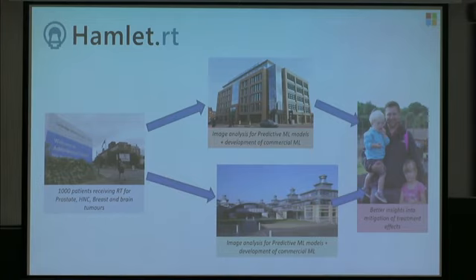So sort of early steps of radiomics, but in a very limited way in terms of endpoints from the image data. And then also to bring in, I've duplicated the caption there, but this should be actually using mathematical techniques, particularly these multitask Gaussian models, to look at the non-image data as well as the image data to try and build these continuous predictive models. And ultimately, this is what we want to do.